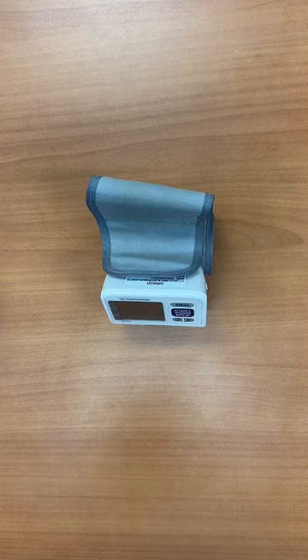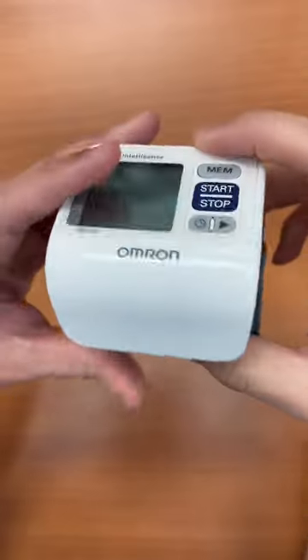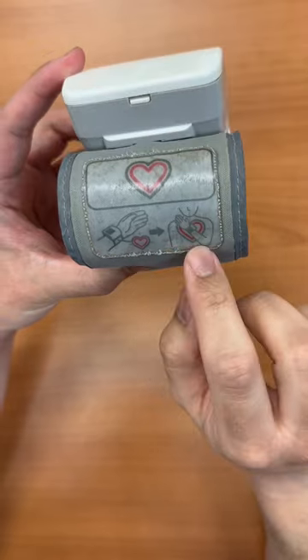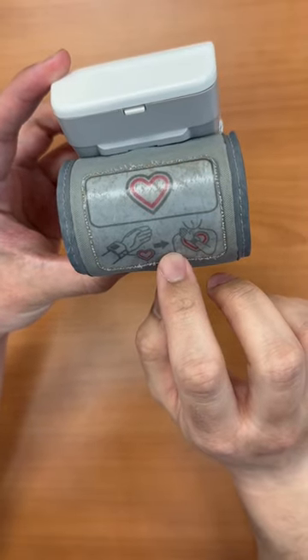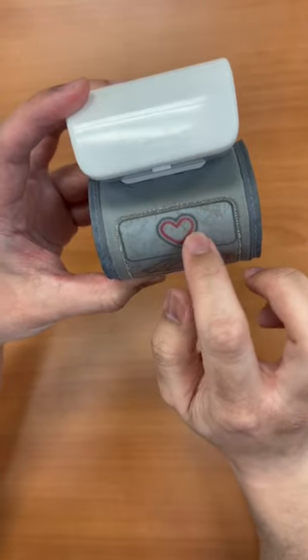Here are some tips on how to use a digital blood pressure cuff. It's always advisable to check the image on the side, as it will usually tell you how to place this particular blood pressure cuff. For this design, you have to place the image of the heart facing the patient.